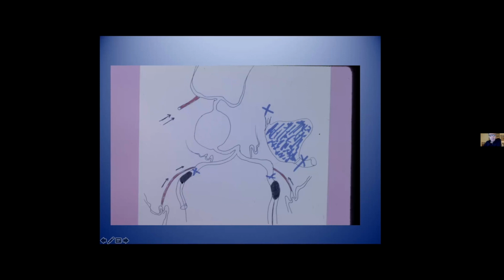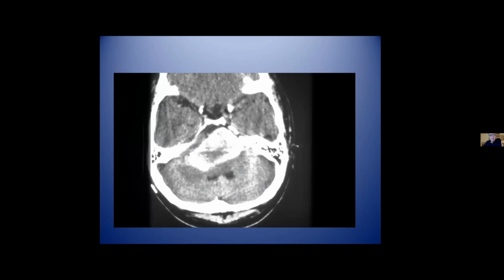I decided to treat it by balloon, bilateral balloon, and I treat it here to produce the high flow in the posterior communicant artery. This is the basilar aneurysm.